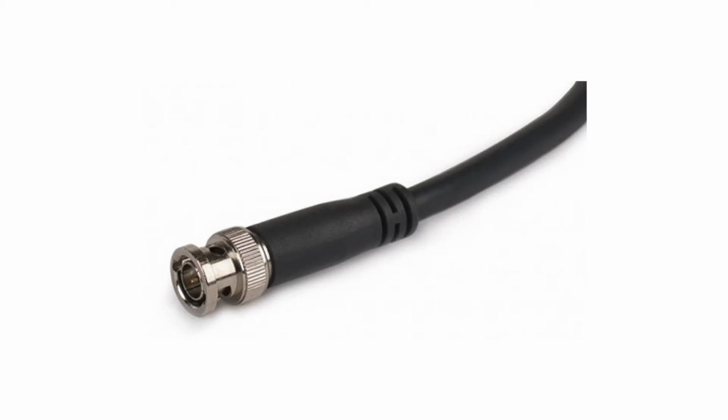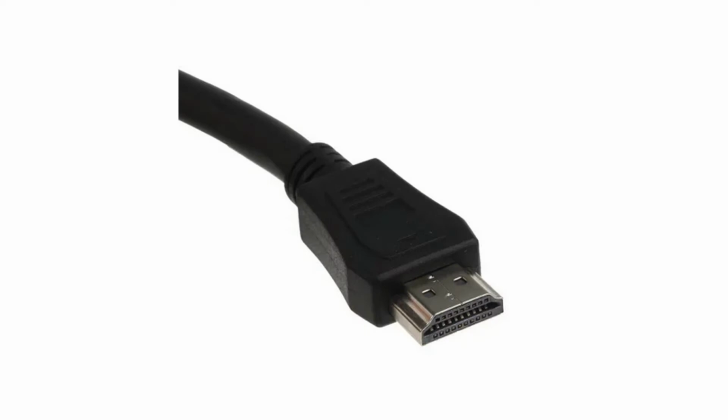Typical connectivity in the operating theatre for video equipment utilises HD-SDI coaxial cables or HDMI cables. And this is fine for standard definition and high definition content. Once we move into the realm of 4K video content, as delivered by the newest medical equipment, there is a bandwidth limitation that this cabling cannot support. This causes a problem when we are designing for future use in the operating theatre.